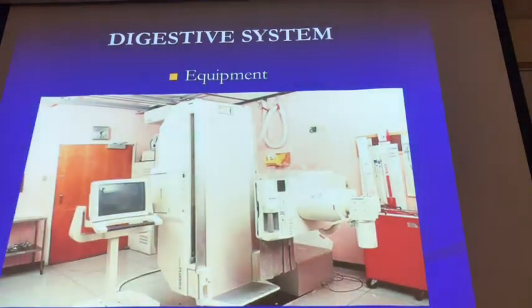Because there are many GI studies where you need the patient standing up so you can see how the contrast media moves, especially when you're doing the esophagus. You want to see it move, okay? We good? Okay, good. Any questions about the picture? No? Okay.